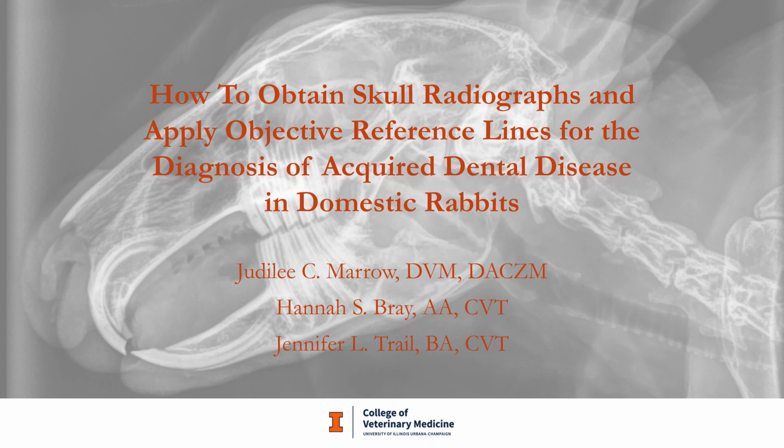In this video, my co-authors at the University of Illinois and I will demonstrate how to obtain skull radiographs and apply objective reference lines for the evaluation of acquired dental disease in domestic rabbits. With a little bit of practice, this procedure is simple to perform in nearly every veterinary hospital and is useful to evaluate rabbits for both intra- and extraoral dental disease. We have no conflicts of interest to declare.